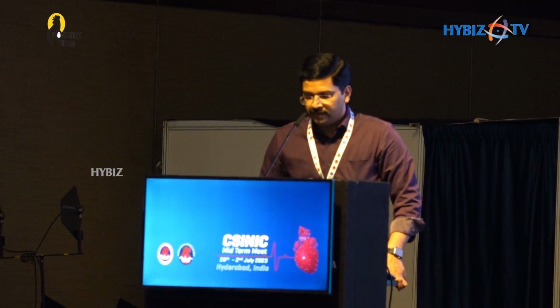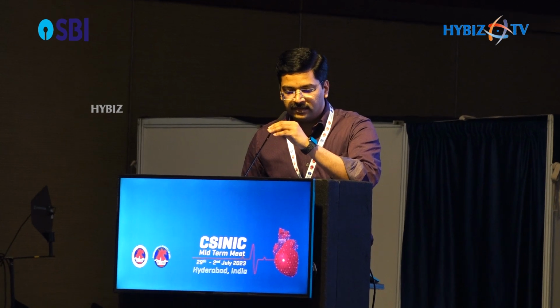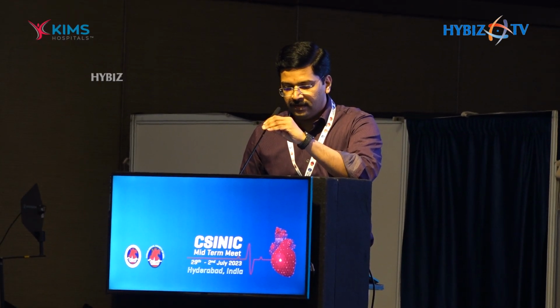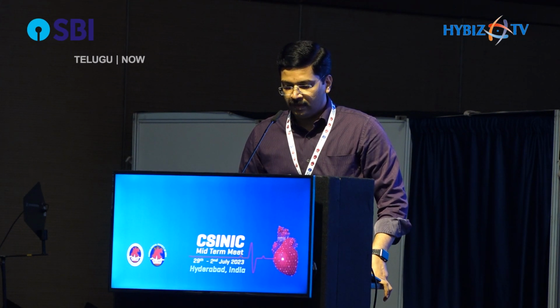This is a story of a 59-year-old male who is hypertensive and diabetic for more than 12 years, came to us with unstable angina, an echo showing good ejection fraction, but the creatinine was 1.3 with an eGFR of 56.5. We proceeded with an ultra-low contrast angiography. We took only 3 projections without panning, with no magnification, which showed a distal LM bifurcation lesion, Medina 111, and in the mid-RCA there was a thrombotic total occlusion.